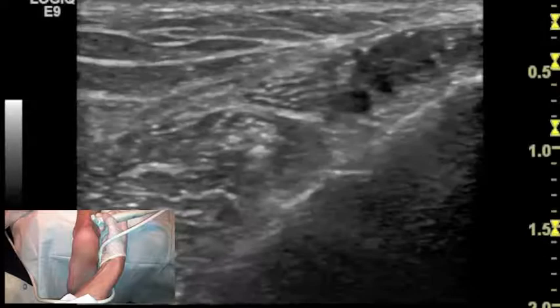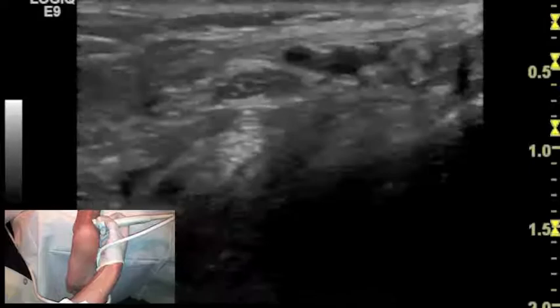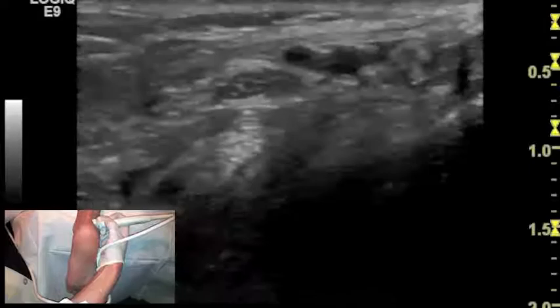Flexor hallucis longus in the posterior aspect of the tarsal tunnel — we scan with the patient prone. You'll see here flexor hallucis longus deep to the neurovascular bundle. We keep as close to 90 degrees, or as perpendicular as possible, to that tendon, which you see in the center of the screen.